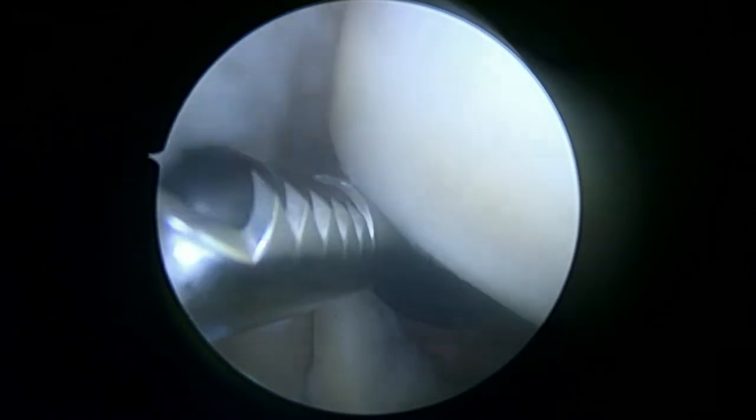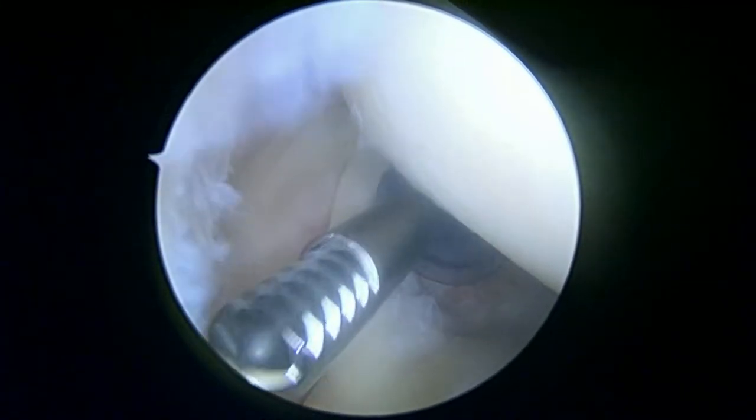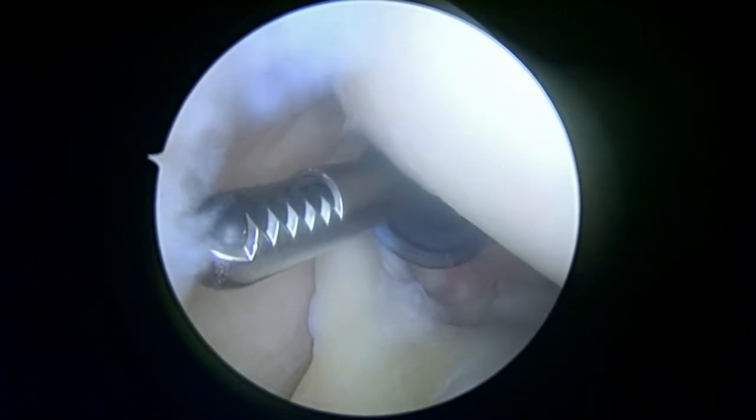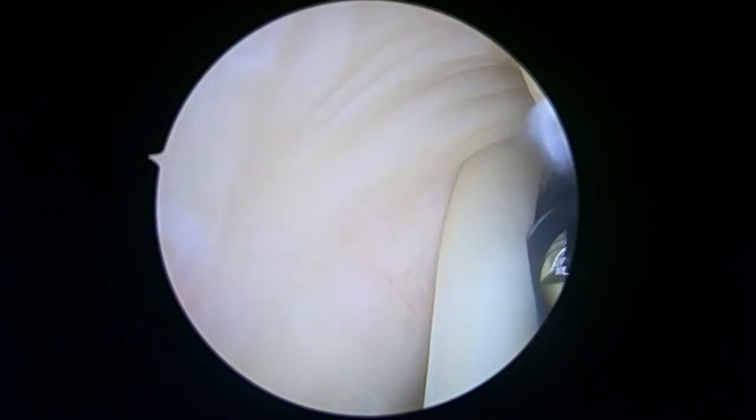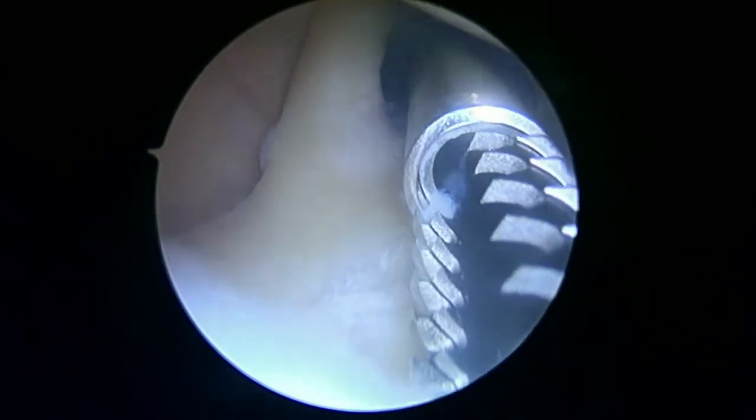We know that we're going to be looking at a rotator cuff here. And that's this area here. The anterior part of the cuff looks pretty good. It's this posterior part of the supraspinatus. So we're going to keep looking here. We'll show you some more in a minute.